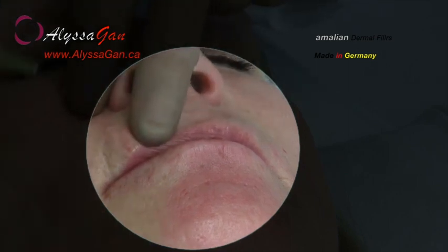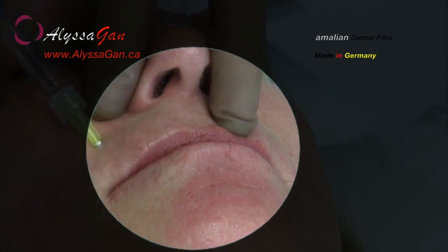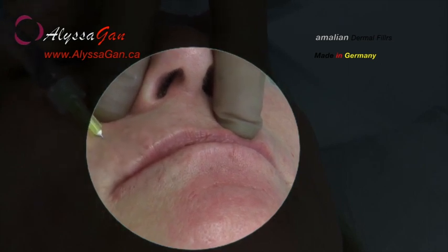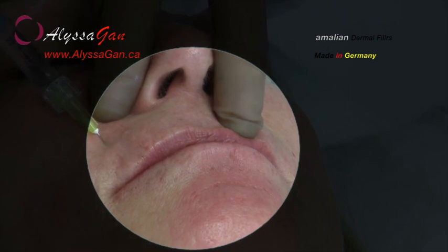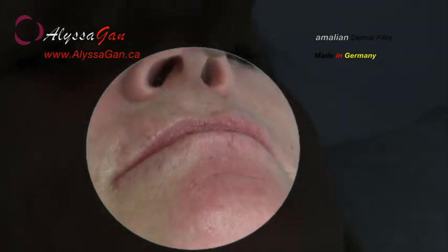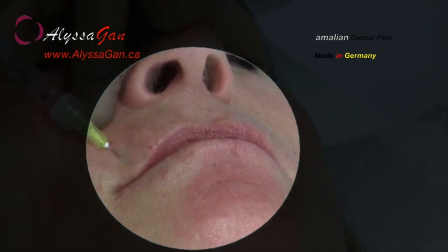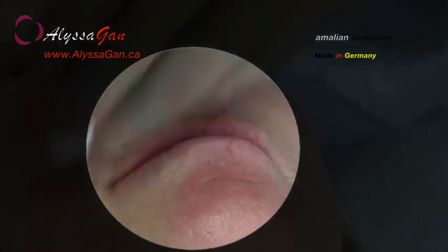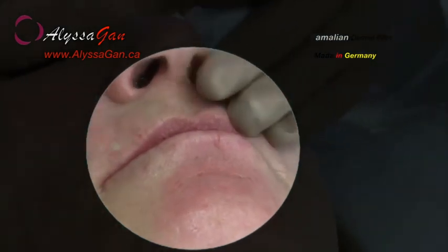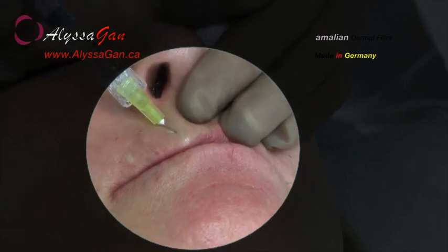More pronounced wrinkles do not only require more volume, but also an injection in somewhat deeper layers of the skin. Fine wrinkles are treated at a superficial level. Because of the direction of the injection, the physician should always be positioned above the patient, so that the injection needle does not come out at the vermilion border, but a little farther away. In this way, bumps on the lip line can be avoided.